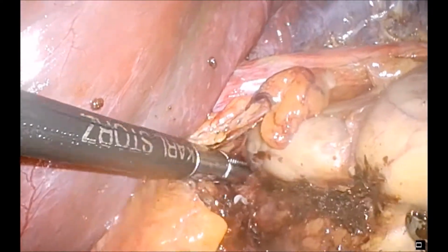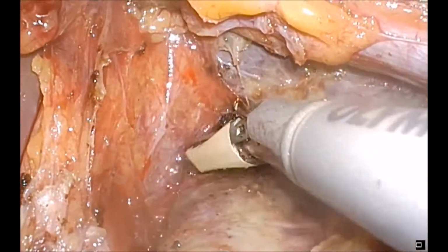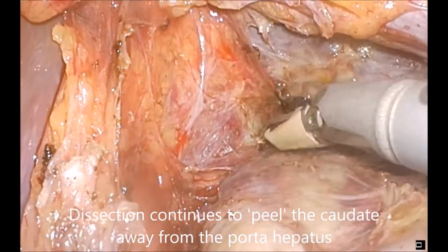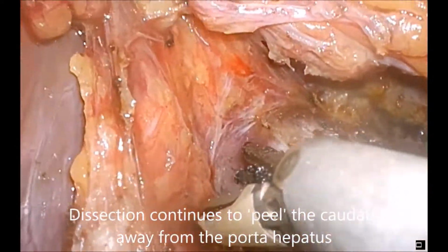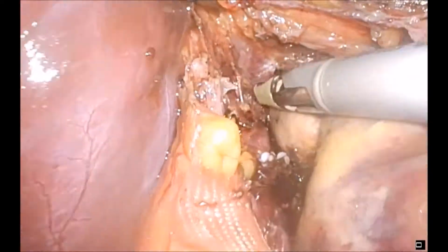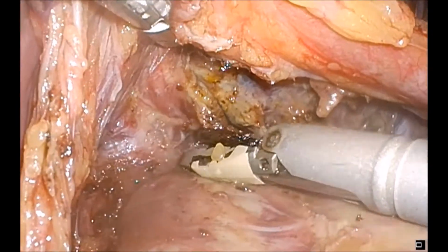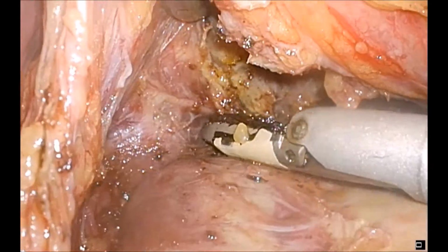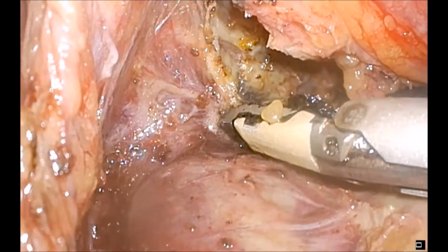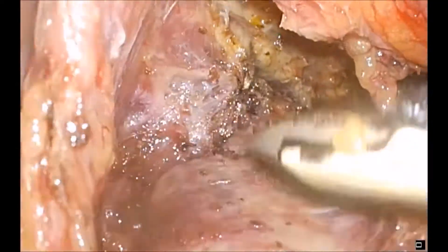So further dissection up near the hilum is undertaken to fully control the inflow to the caudate and peel the caudate lobe away from the portohepatic structures, which are obviously vital to the remnant liver. It's a laborious process, trying to find the right plane and staying outside of the parenchyma of the caudate and the left lobe of the liver.